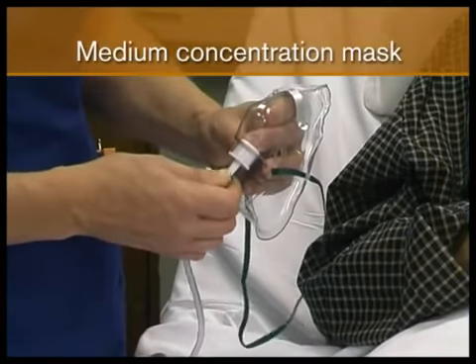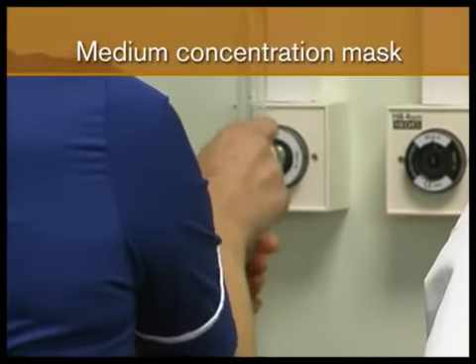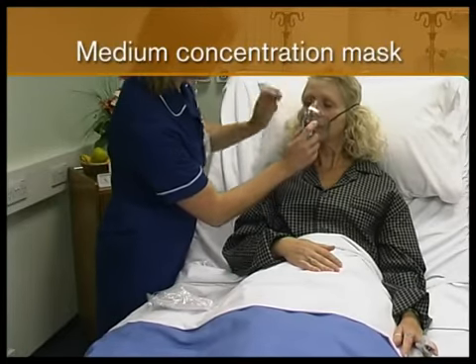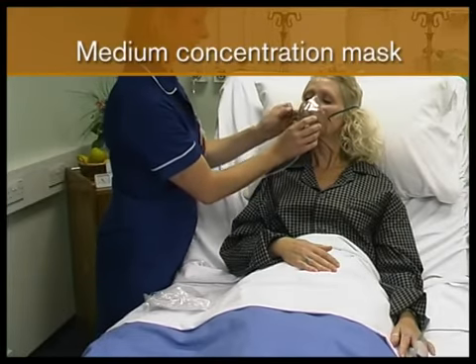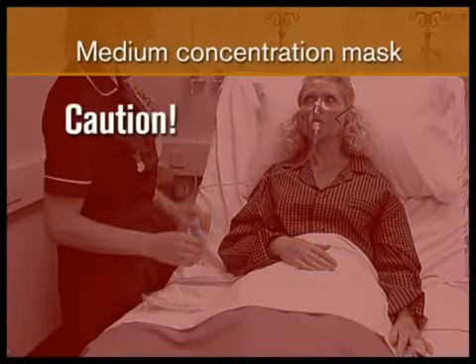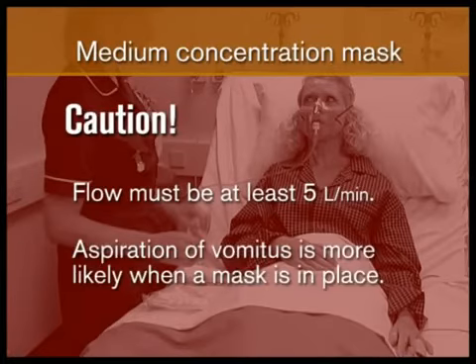One end of the oxygen tube is attached to the spigot on the mask and the other to the oxygen flow meter. The flow meter is set to give the prescribed oxygen concentration. The mask is then fitted over the patient's nose and mouth, and the elastic tightened to give a secure, comfortable fit. If the mask has a nose clip, it is pinched to provide the best possible fit. Caution: flow must be at least 5 litres per minute to wash CO2 out of the mask and prevent rebreathing. Aspiration of vomitus is more likely when a mask is in place.